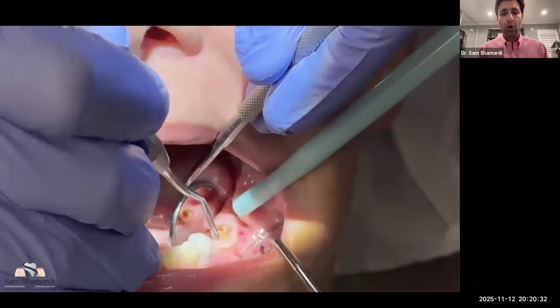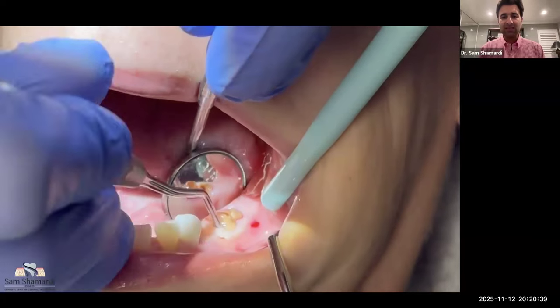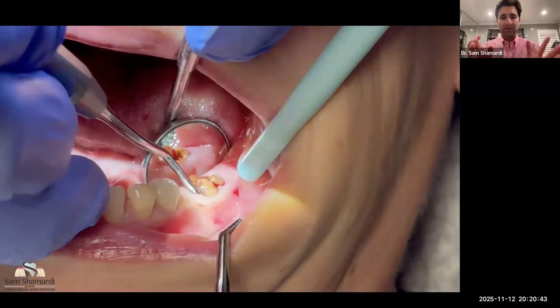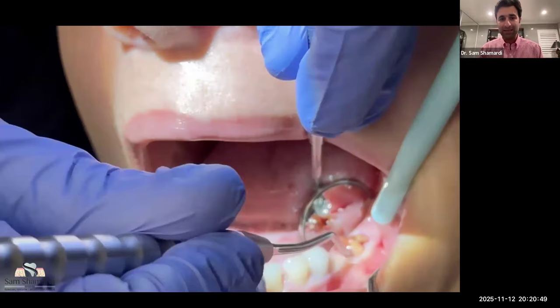We're then going to come with our targeted exotomes. Like we mentioned, we put our periotome in. We come in with our exotomes. Again, we use these as we would a traditional elevator, but we use them on both. In this case, this exotome is targeted specifically for that mesial root. You can see I've already been able to do the majority of the luxating there.